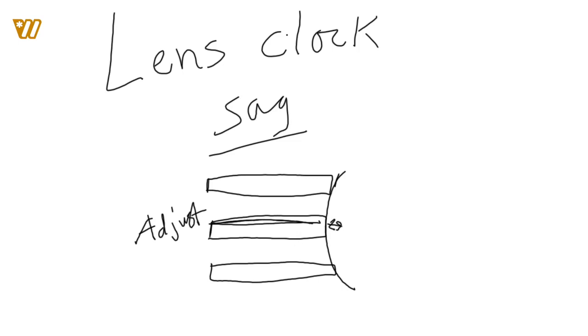Now, some of you guys are like, Ryan, I don't remember the lens clock very well and I haven't seen it in a long time. Well, just next time you're in clinic, go to your optical. They're going to have a lens clock somewhere. They're probably going to have to dust it off a little bit, but that way you can look at it and get an idea of what's going on with your lens clock.